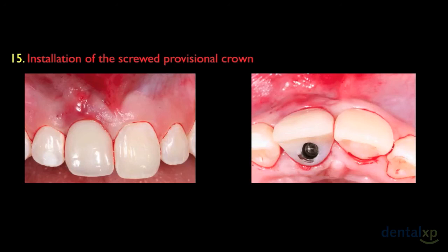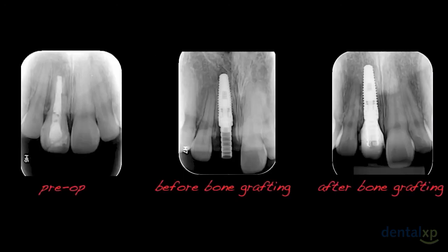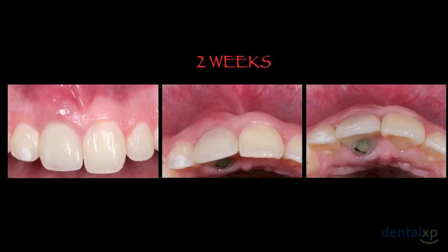Just to note, in this case the provisional crown is shorter than the contralateral tooth to be out of occlusion. Following this sequence — before, after implant insertion, and after bone reconstruction — you can notice total filling of the gaps. Here, two weeks later, we can see the healing process of soft tissues, good repositioning of the gingival margin, and maintenance of soft tissue volume.